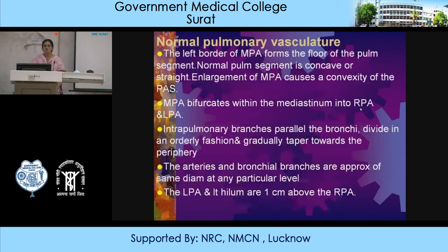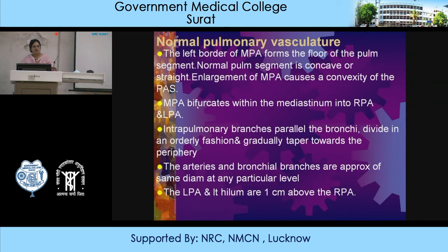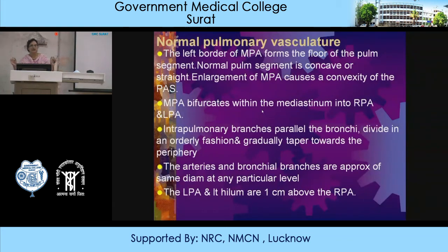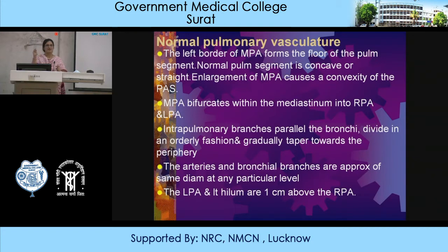Normal pulmonary vasculature: the left border of the MPA forms the floor of the pulmonary segment. The normal pulmonary segment is concave or straight; enlargement of the MPA will cause convexity of the pulmonary arterial segment. The MPA bifurcates within the mediastinum into the right and left pulmonary arteries. Intrapulmonary branches parallel the bronchi, dividing in an orderly fashion and gradually tapering towards the periphery. The arteries and bronchial branches are approximately the same diameter at any level. The left pulmonary artery and left hilum are 1 cm above the right pulmonary artery because the left pulmonary artery arches over the left main bronchus.